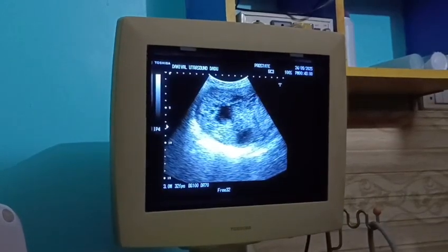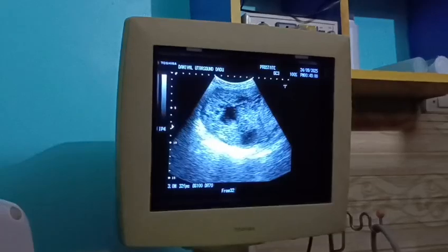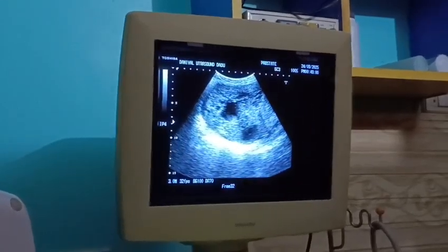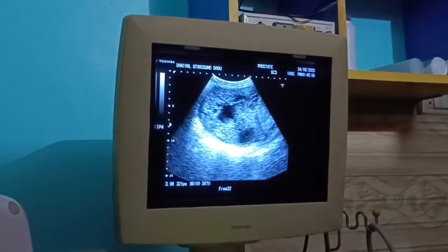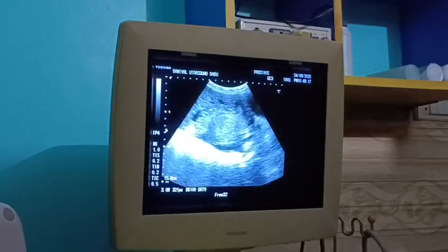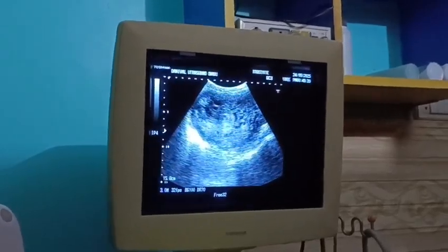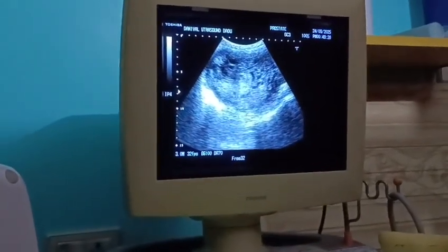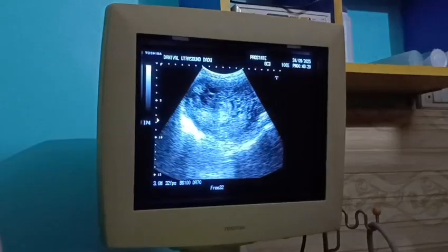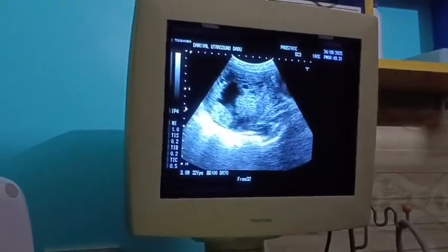This is a trophoblastic disease characterized by abnormal proliferation of trophoblastic tissue with swollen cystic chorionic villi. Sometimes it looks like a sponge filling the entire uterine cavity. So in this ultrasound, the findings show that there is a partial mole. There are two types, partial and complete.